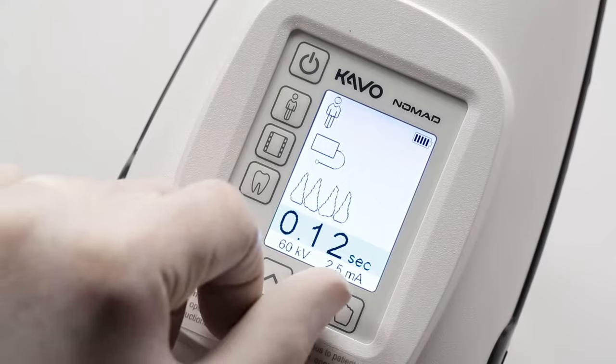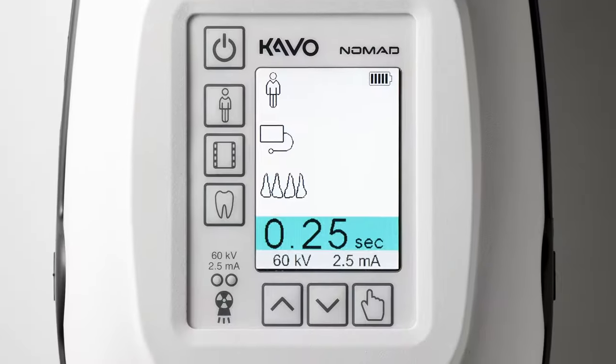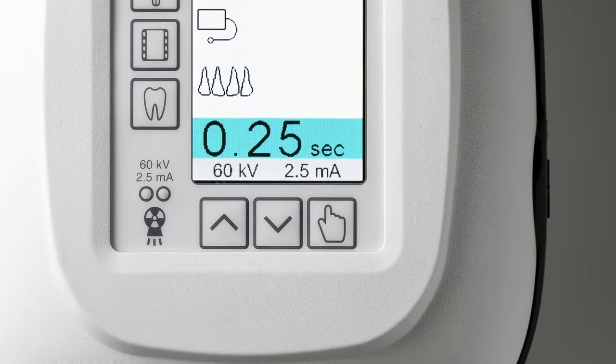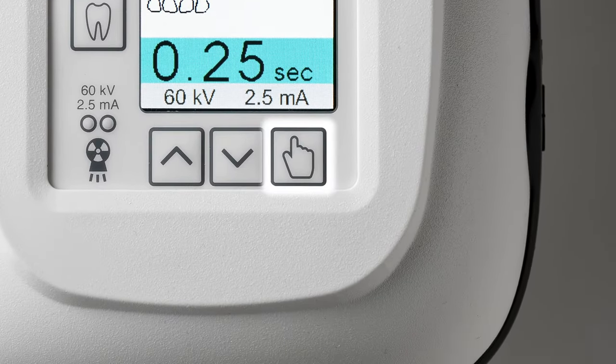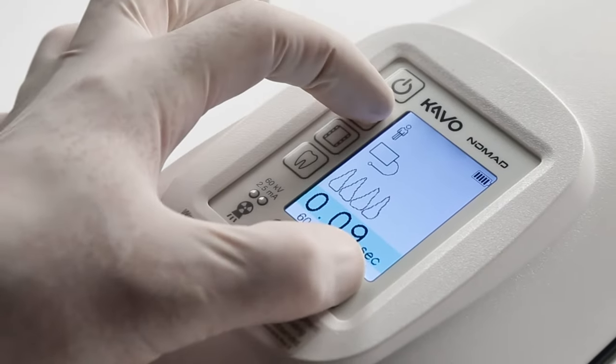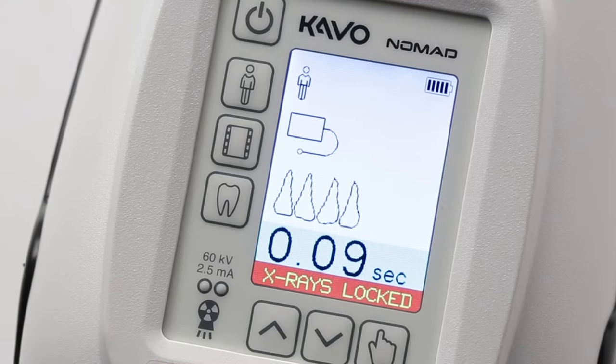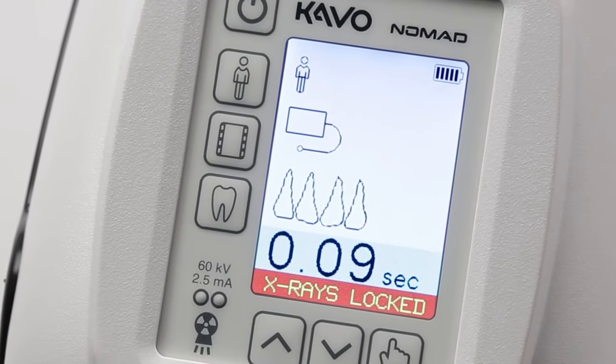As a security measure, the X-ray feature on the Nomad can be disabled or locked when not in use and when stored after use. You can lock or unlock the X-ray feature by pressing and holding down the select button, then pressing the patient button. The device shifts into an X-ray locked state and the buttons can then be released. Notice the X-ray locked message at the bottom of the display.